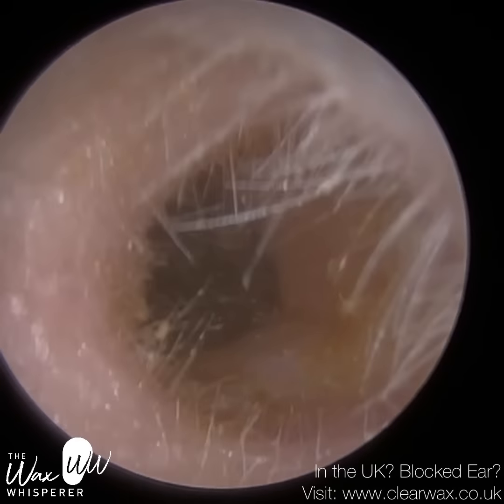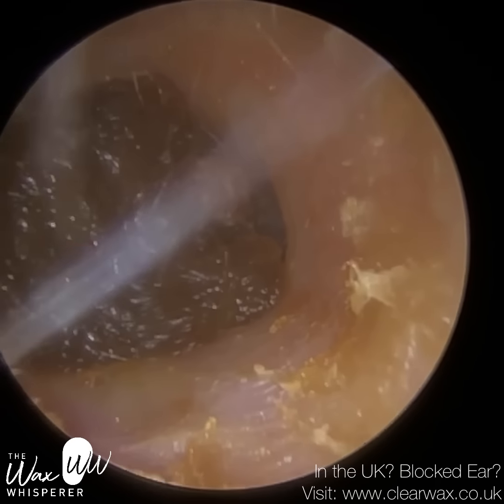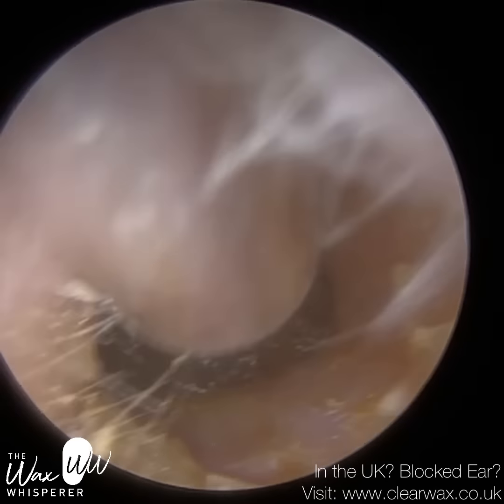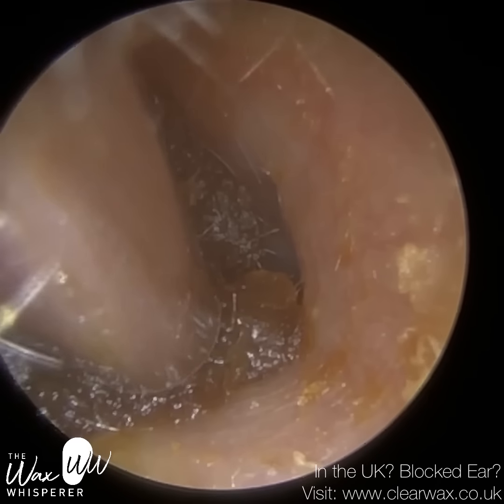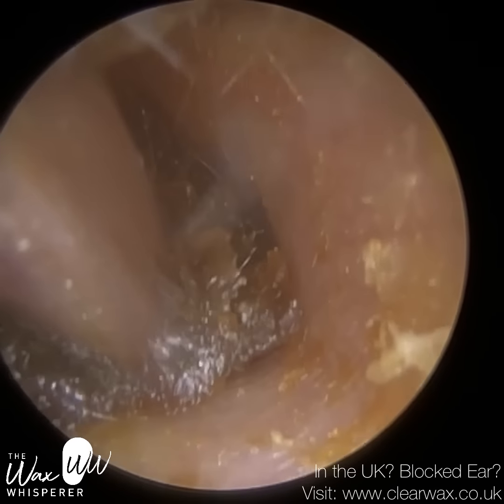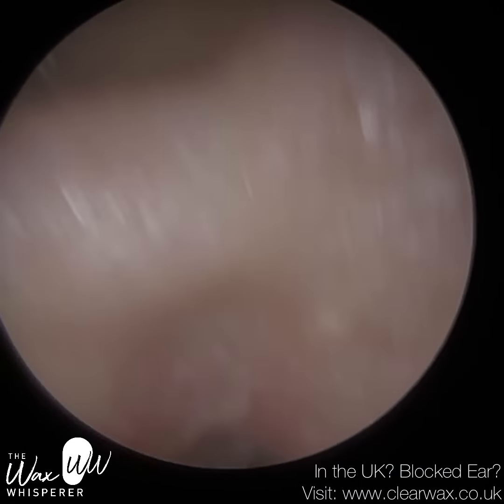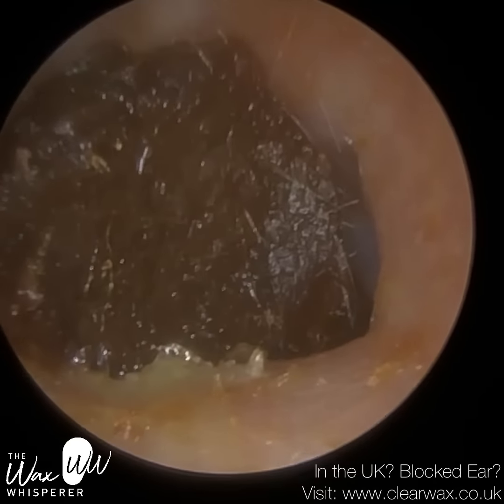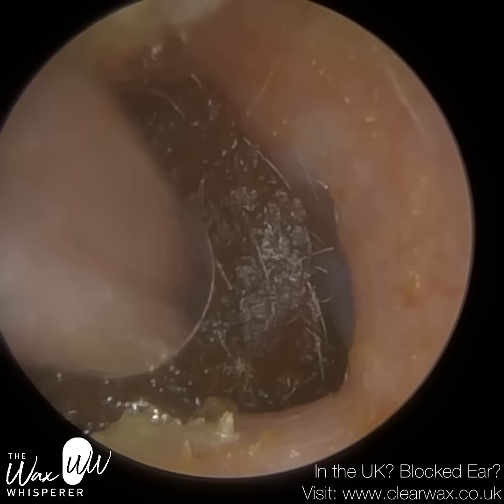Now, for a really small ear, this ear was really packed with wax. So I took a big lump out there and I thought, okay, just one more piece of wax, which is a bit deeper in the ear. You can see it was a bit of a challenge even squeezing the suction probe in there because of the narrowness. So you'd be surprised how many times I go in and out of the ear just removing wax, and it was almost like the never-ending ear. The ear that kept giving, this one was.